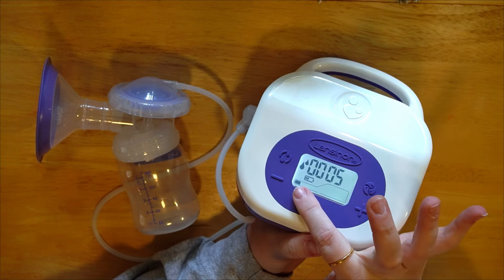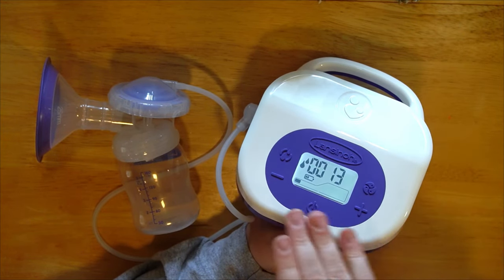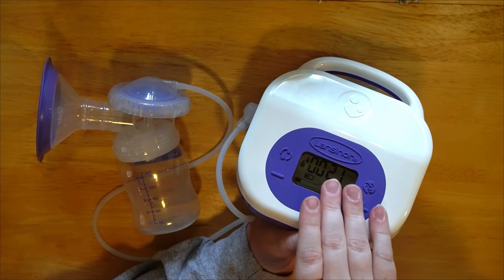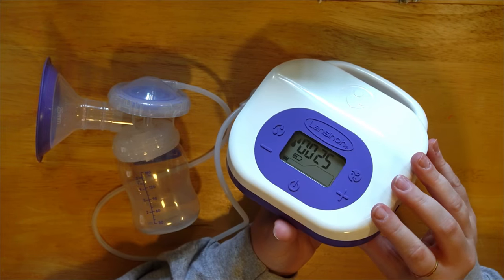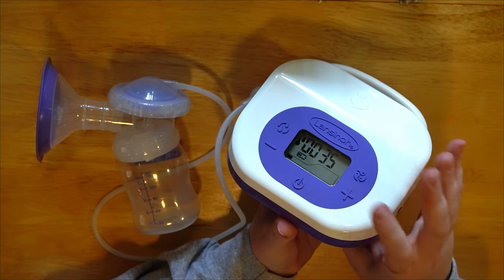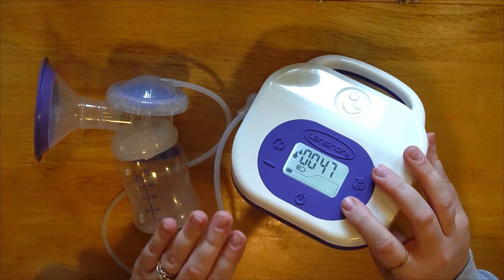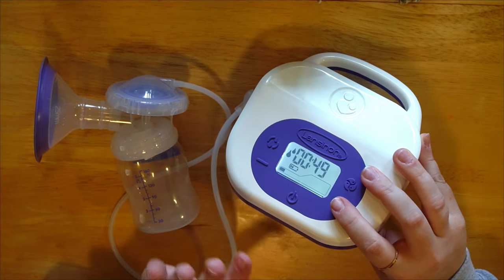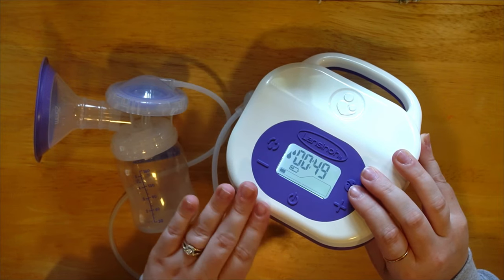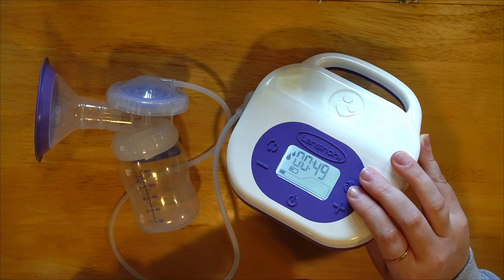When I turn it on it starts in stimulation mode at a very low level — this pump will remember your settings from last time. I'd recommend keeping it low when you start; you can always turn it down before hooking up. The LCD screen dims to save power but it's still timing — press any button and it comes right back. For suction level, start low and go high. Pumping should never be painful — uncomfortable maybe in the early postpartum days, but painful indicates a problem.